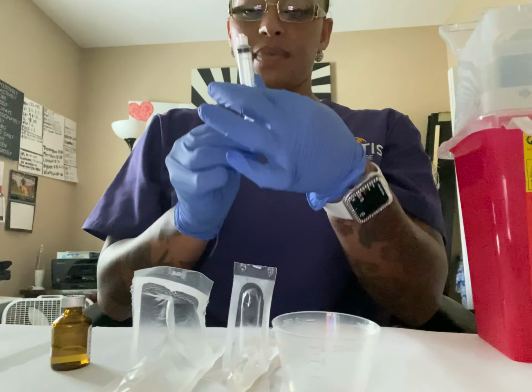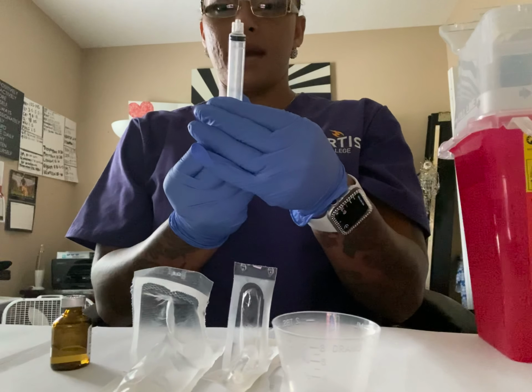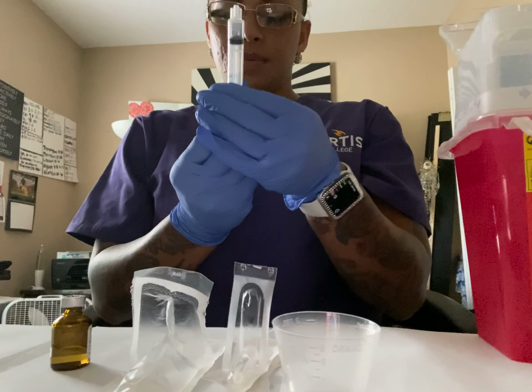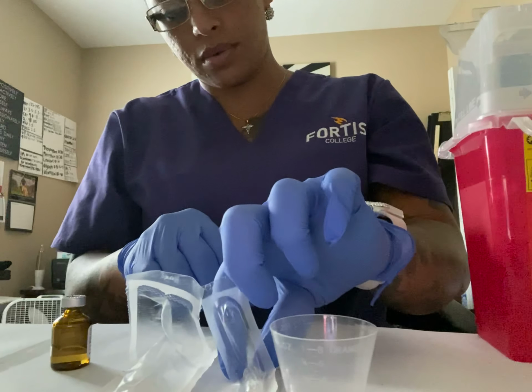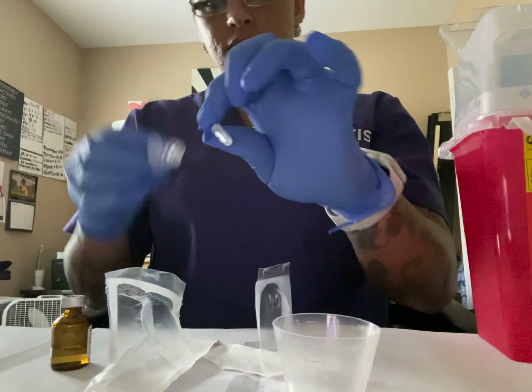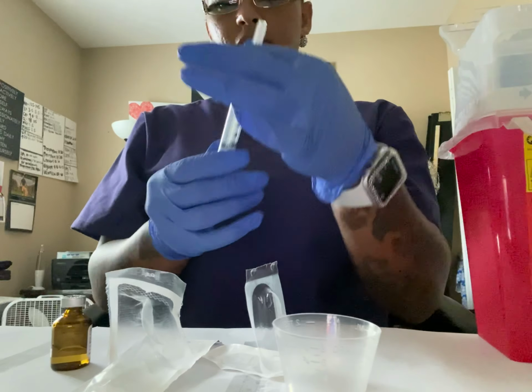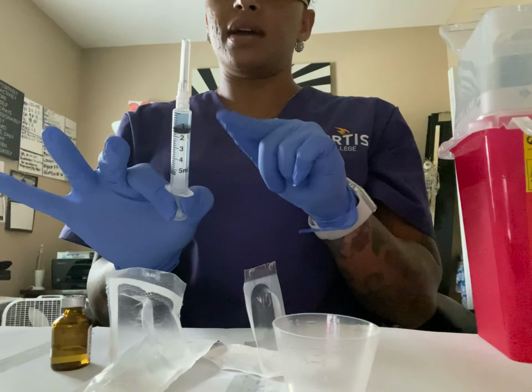Okay. So I'm going to pull back to 1.5 milliliters of air. Okay. And then I have my needle here. I'm going to go ahead and cap my needle onto the syringe. Okay, so as you can see, I have 1.5 milliliters of air already in there.